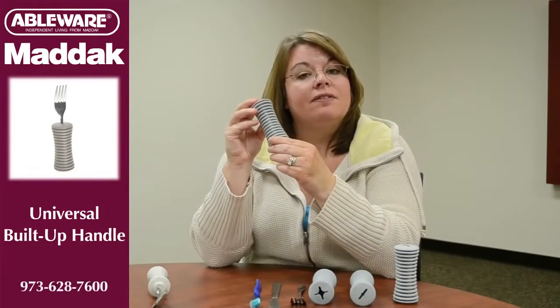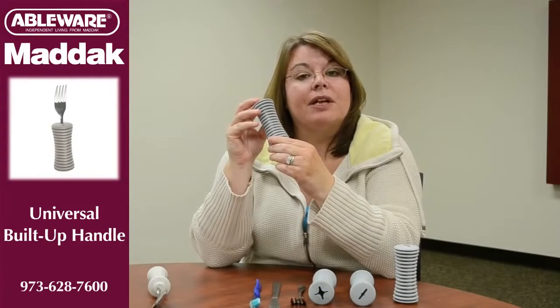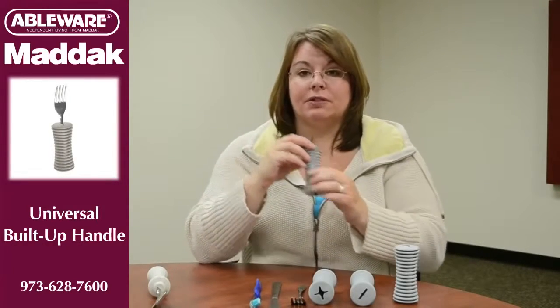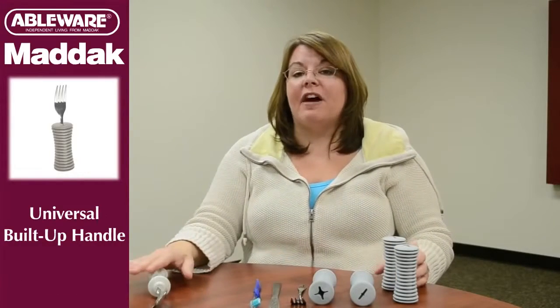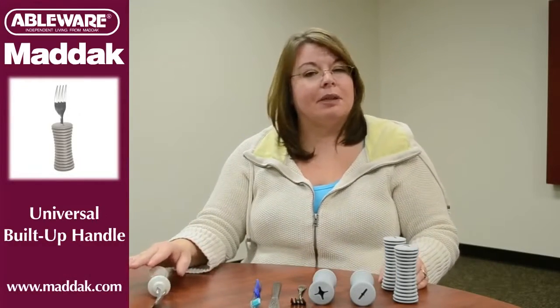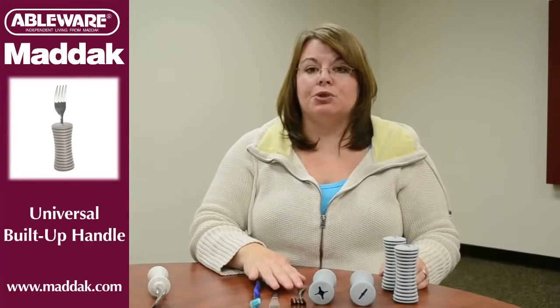This soft, flexible handle is comfortable and easy to hold. What's really nice about the universal handle is that you can use it with standard utensils. So instead of having a drawer full of built-up utensils that take up a lot of space, you're going to use what you already own.